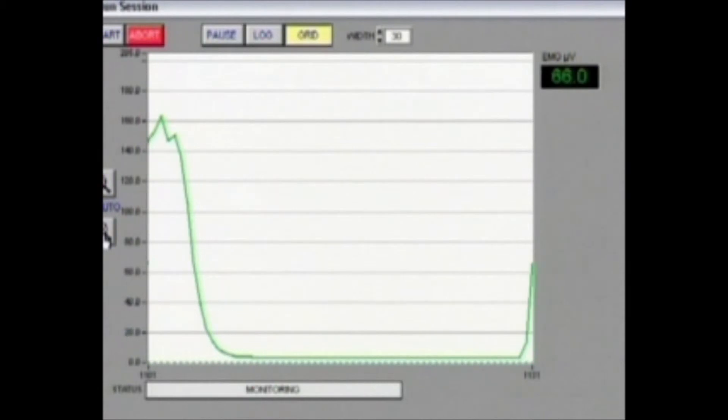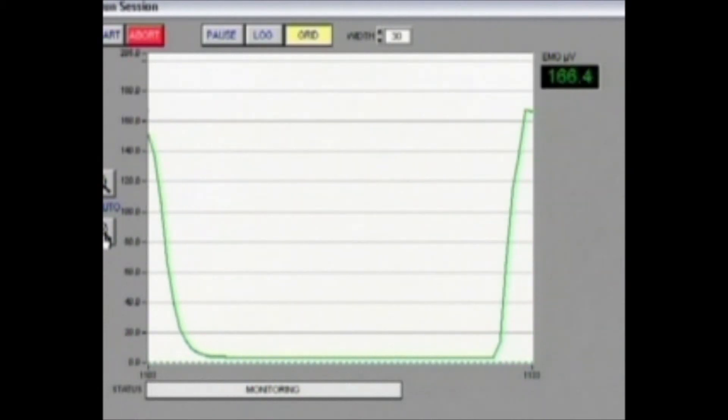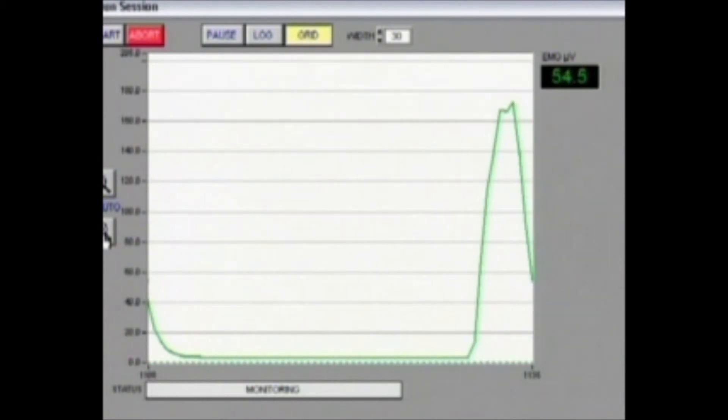One more clench, just as hard as you can go. She actually got to 172, again demonstrating the fact that it's possible to clench with even higher intensity with the full mouth splint than with just an ordinary clench without anything in the mouth.